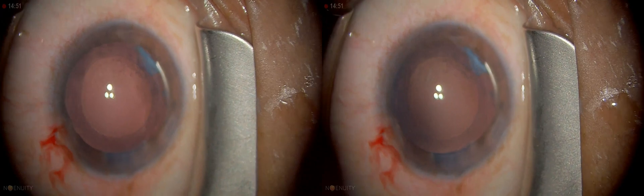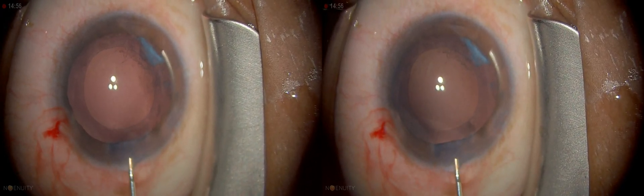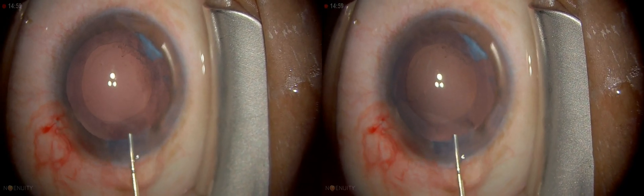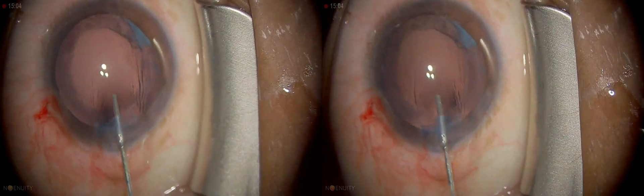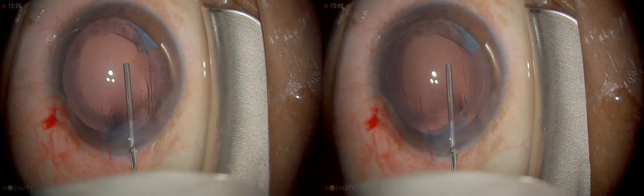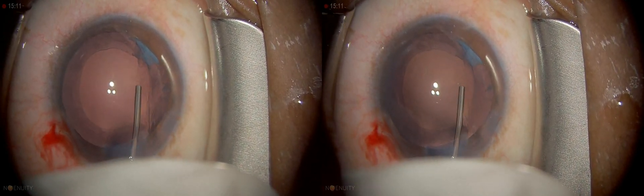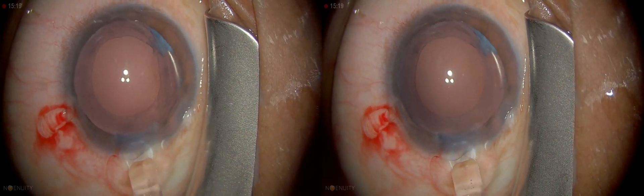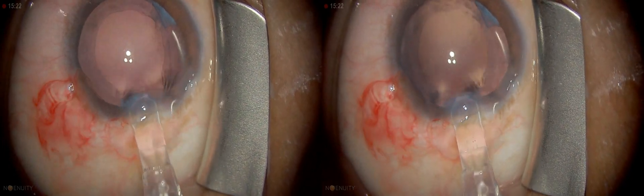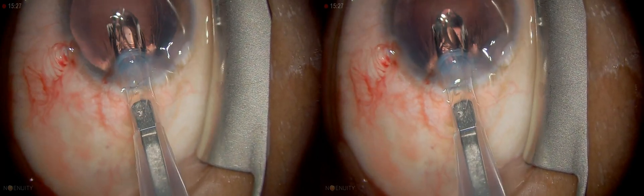This is Provis, to inject the lens. I'm very careful — I'm going to start injecting before I really enter the anterior chamber, to open up the lips of the incision. Then going in and injecting into the bag to open it up very nicely. Lift the superior lip upwards and start gently injecting. Tilt the lens downwards as it goes in, so it goes directly into the bag.